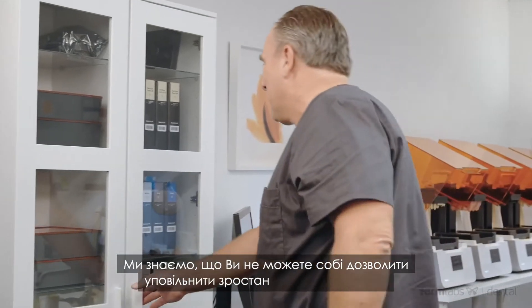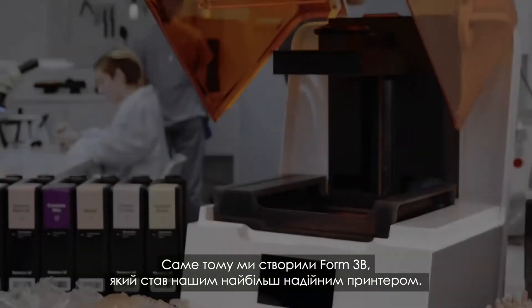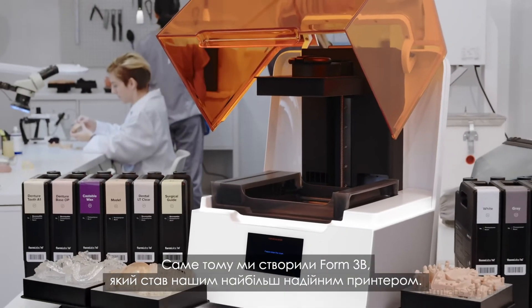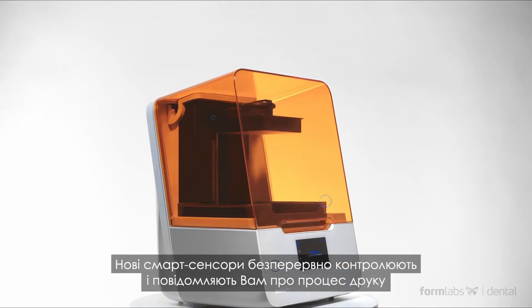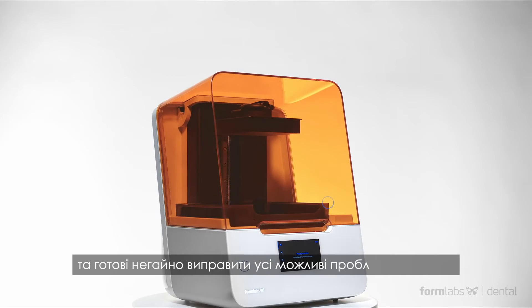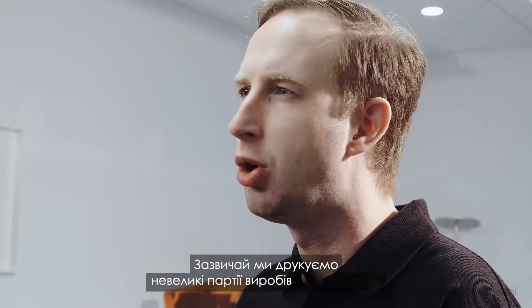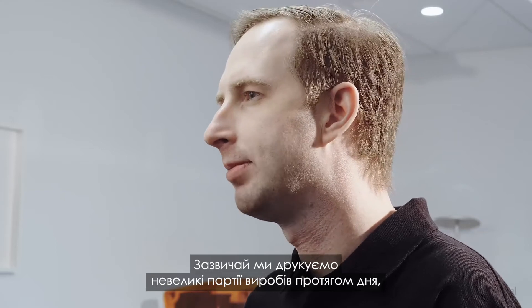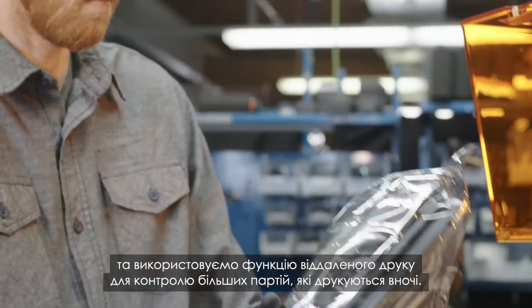We know your business can't afford to slow down. That's why we designed the Form 3B to be our most reliable printer ever. New smart sensors constantly monitor print progress and keep you informed and ready to promptly address potential issues. We usually run smaller batches of parts during the day and use remote printing to monitor larger builds that run during the night.